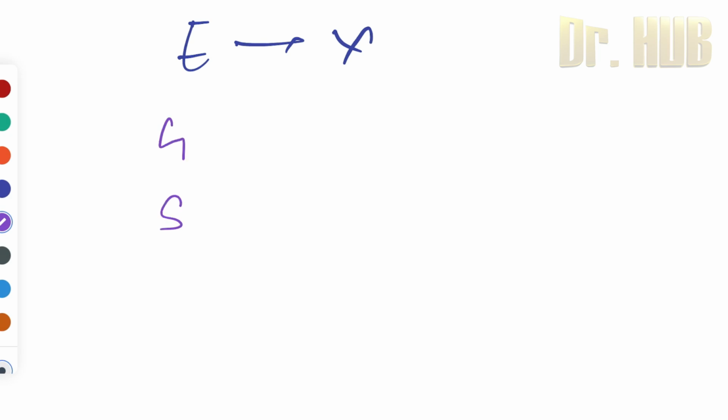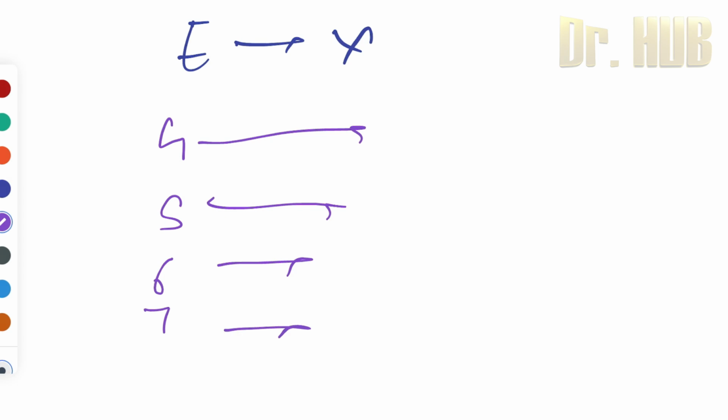The Ryles tube length measurement is from the nose to the ear and from the ear to the xiphisternum. Nose to the ear to the xiphisternum. The Ryles tube marking, there is about 40 cm, 50 cm, 60 and 70. So we're writing it as 4, 5, 6, 7.